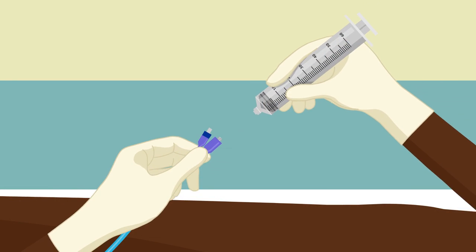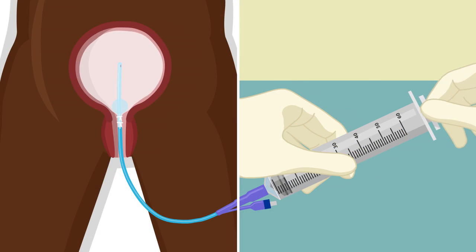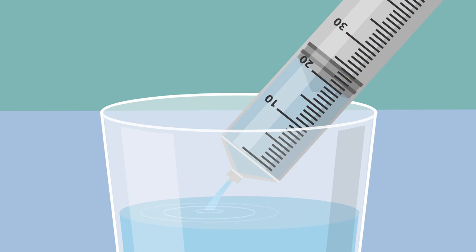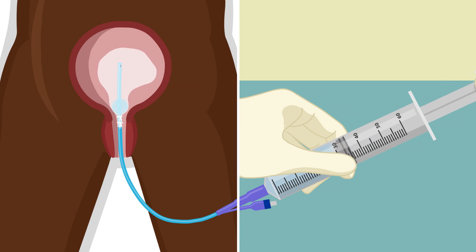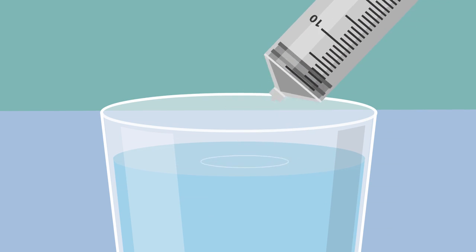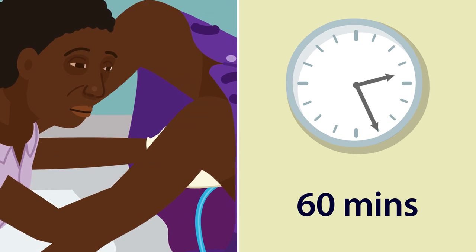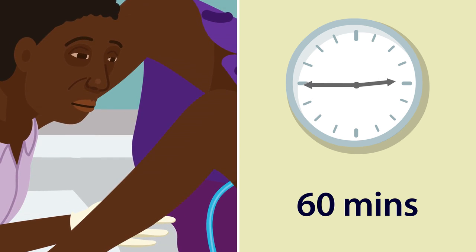In order to remove the UBT, Grace attaches the syringe to the catheter and slowly draws out one or two syringes full of water to lower the pressure without taking out the balloon. She watches for 60 minutes. If the bleeding starts again, Grace must refill the balloon with clean water and arrange for Mary to go to the nearest hospital.